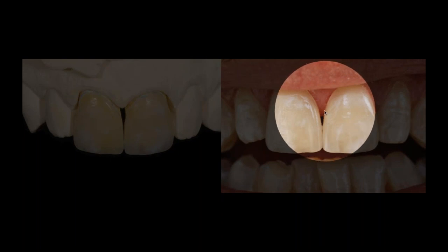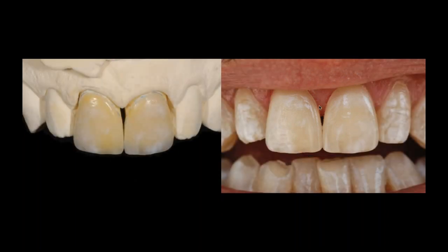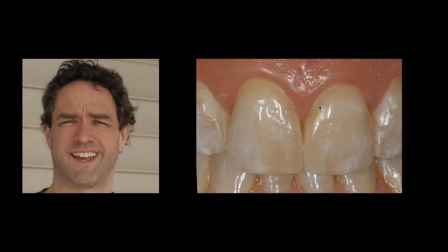And I said, oh, you know what, Doc? We're fine. Don't worry about it. Matter of fact, I would tell you, go back and take another picture, and let me see what that looks like in 5 or 10 minutes. And I have a feeling we're going to be okay. And sure enough, 5 or 10 minutes later, he took another picture, and that papilla was fine.